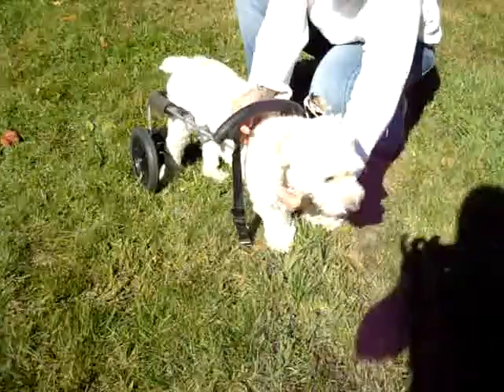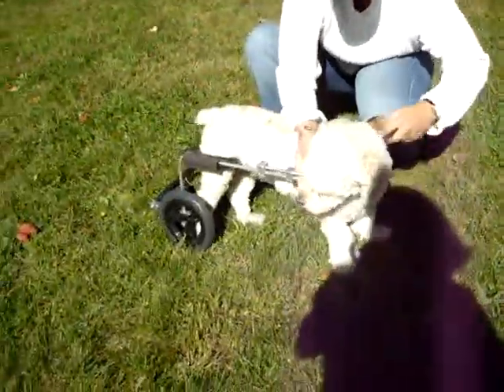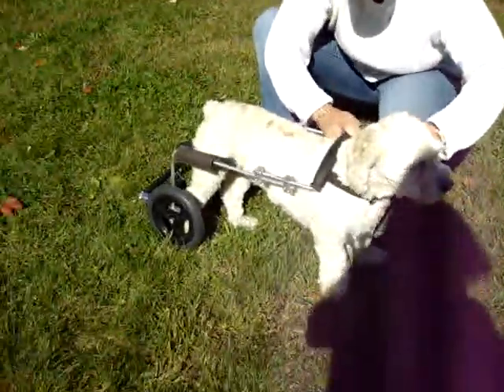So hustle good, baby. Good girl. Buckle the chest strap. Oh my God, this is like night and day. This is very easy.